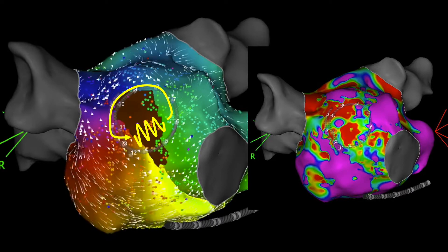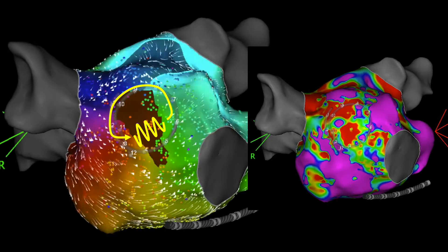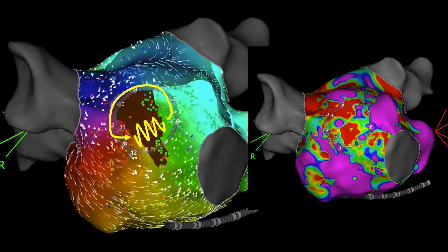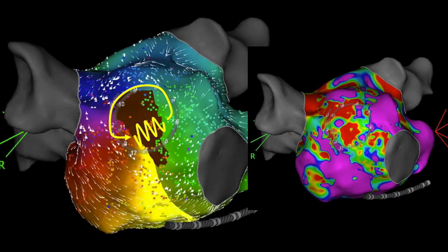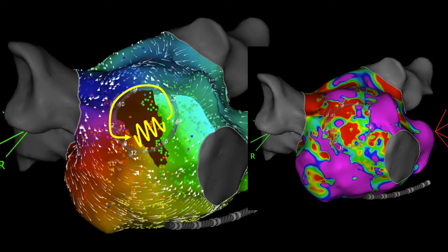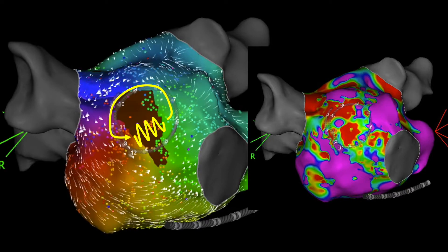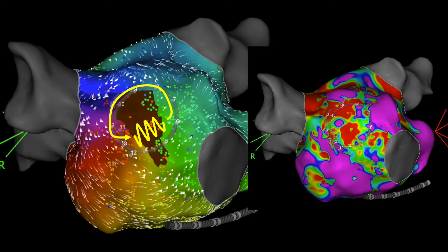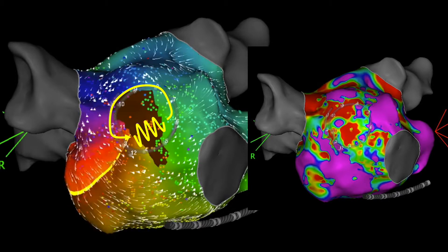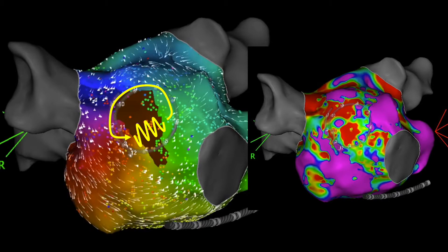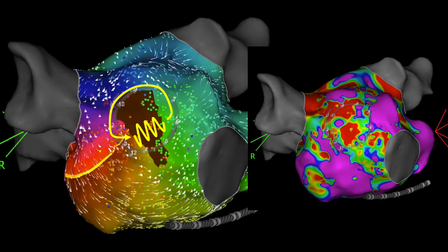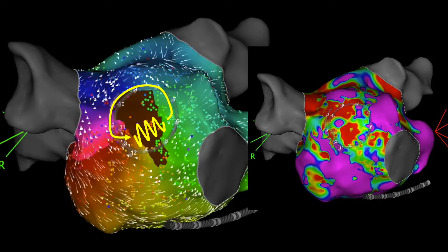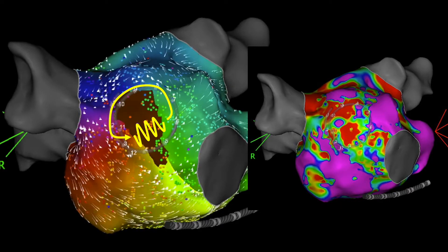Ablation of post-AF ablation atrial arrhythmias can be highly successful, but needs to be balanced against the potential risk of stiff left atrial syndrome after extensive ablation in the left atrium. Therefore, detailed substrate and activation mapping, entrainment mapping, and targeted ablation are very important in these patients to prevent this complication.